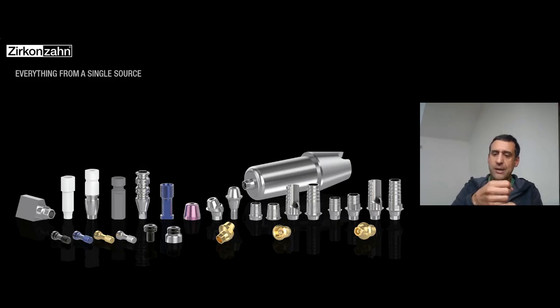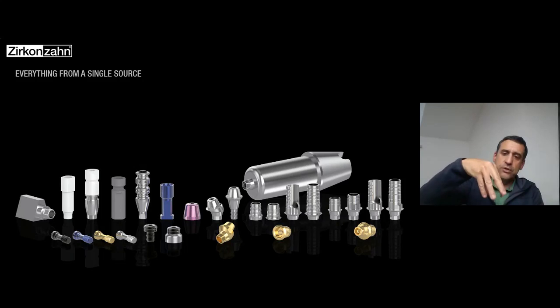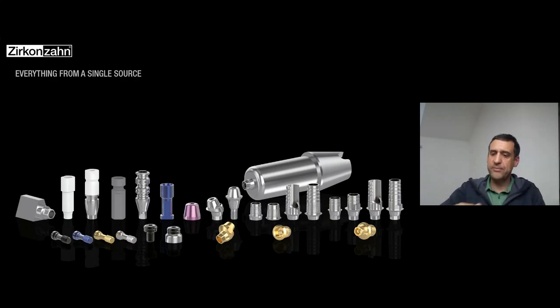Remember, type 1 and type 2 are different connections to the implant. The multi-unit on top is the same, but the connection in the lower part, the bottom, is different. And in gold or in regular, and different T-bases: the narrow, the normal one, the K85 open, and the K80, the hide one, and different heights of the normal parallel T-base, and the K80, K85 parallel.